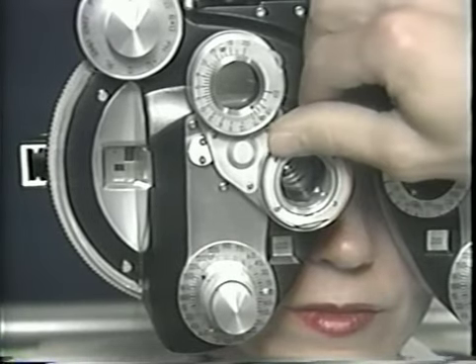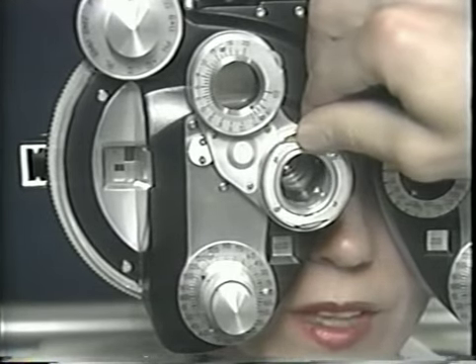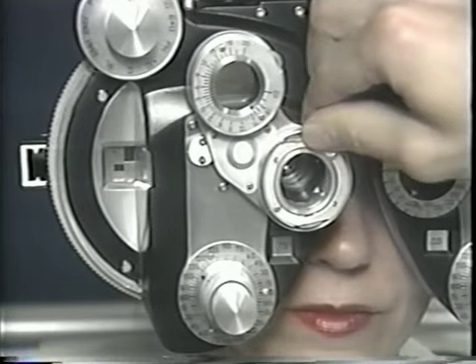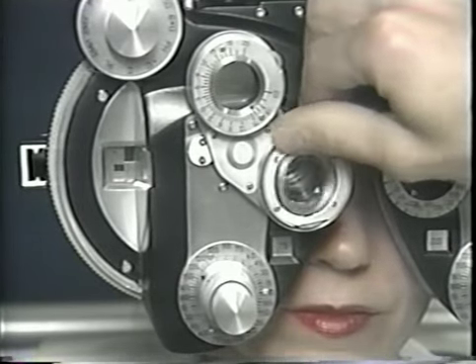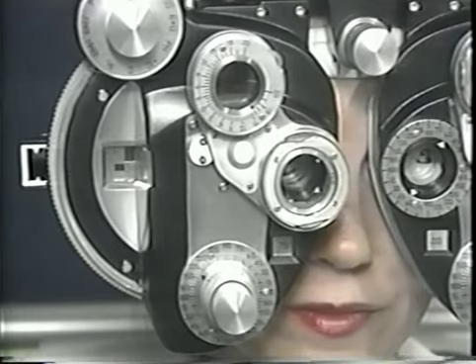Which is better now, 3 or 4? 3 or 4? 3's better. Now which is better, 5 or 6? Or are they about the same? 5 or 6? They're about the same. Good. Let's see the same sequence from the patient's view.